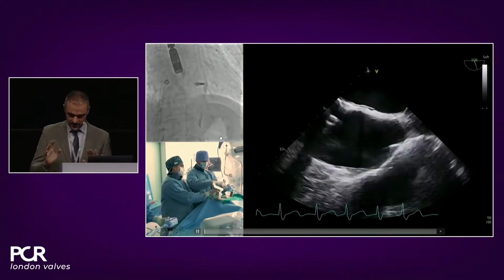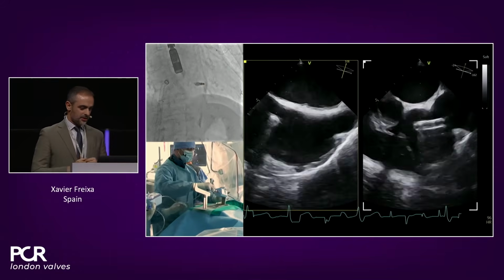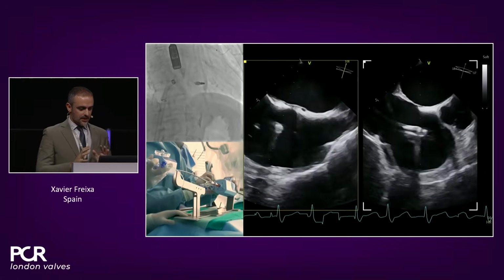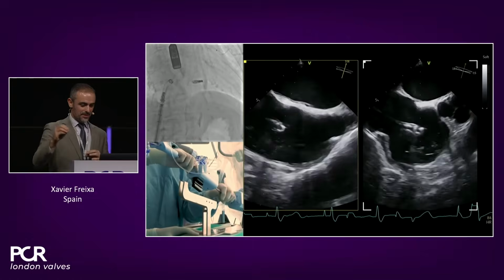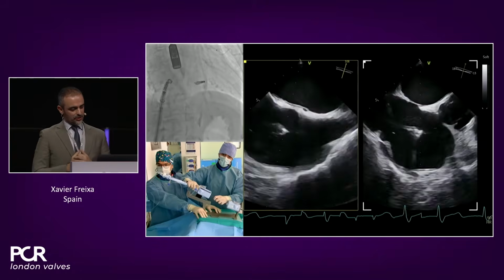Right, so why don't you show us what you did? Well, actually, we kept on with a plan that Laura explained at the beginning. Remember, first clip, anteroseptal XTW, and the second one would be, if it works, posteroseptal, P1 septal, central, XTW as well, to reduce this gap. So here, I would say, advancing a second clip, once you have all these anatomical references and you have the clip in position, it's much easier.